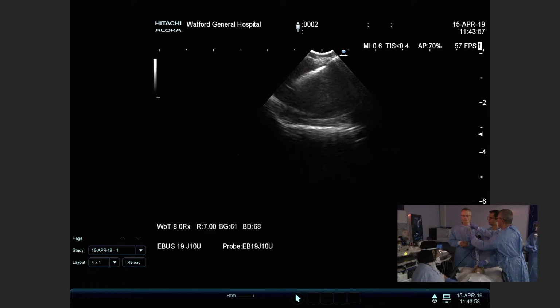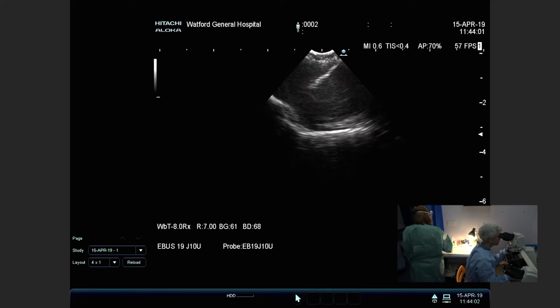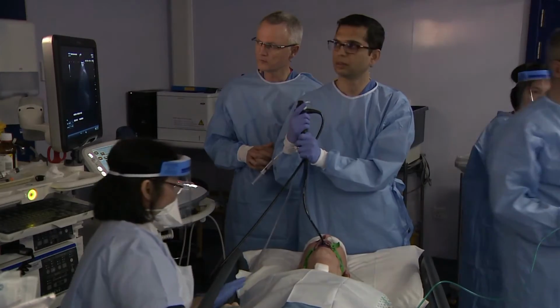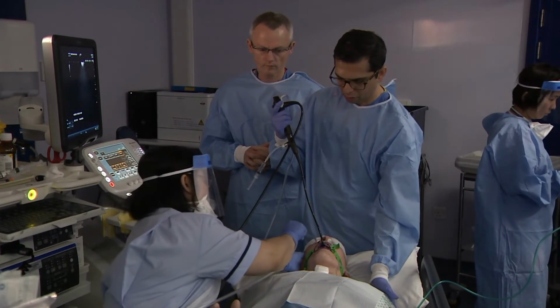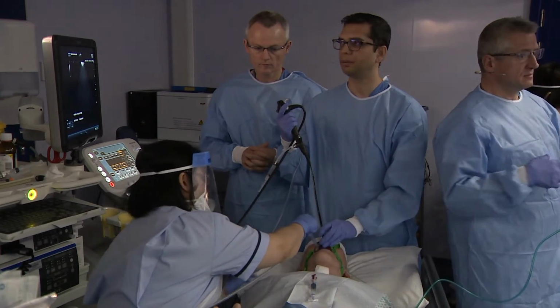In terms of the volume that we're getting, I think not very much. The second pass was pretty scanty. If we're getting scanty, should we switch to ProCore? I don't think so. I think you've got a little bit of secretions at the back of your throat. We're just doing a little bit of suctioning. Bear with us, you're doing really well.